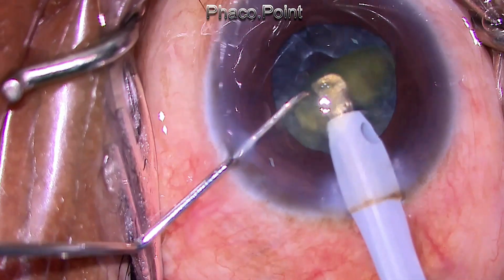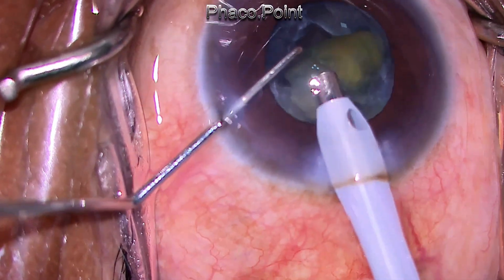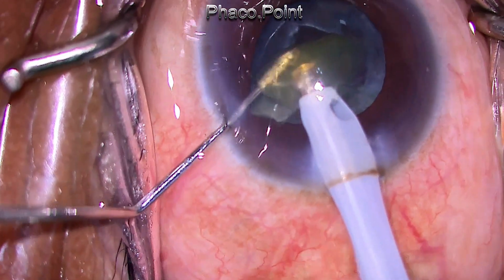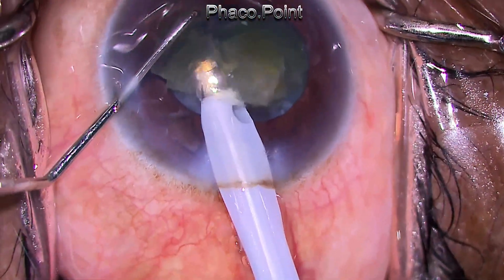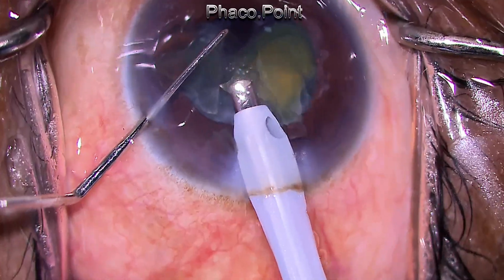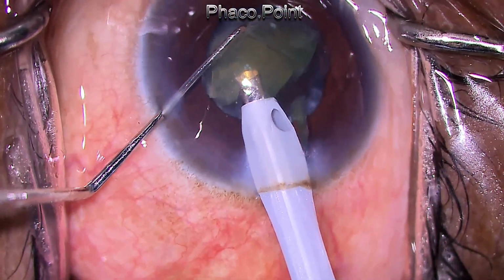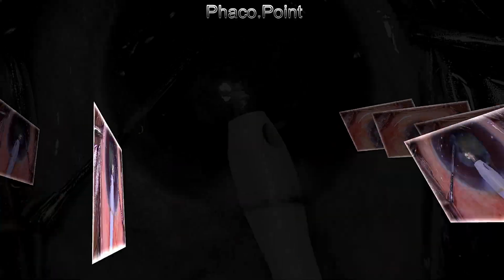a meticulous handling of the nucleus fragments which are performed with the Phaco emulsification. She's using a Phaco power of just 30%, a vacuum of 300 millimeters of mercury, and she's using the pulse mode of Phaco emulsification. Observe the surgery carefully and see if you can make out any particular glitches or drawbacks in the surgical technique that's being employed. The procedure that's being done is a stop and chop technique of Phaco emulsification.